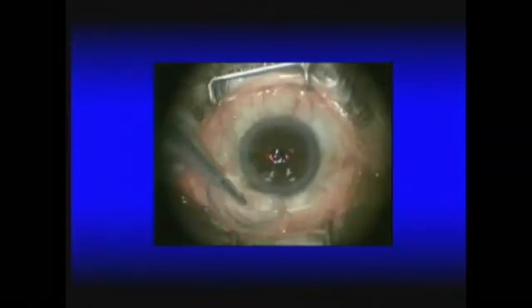I don't like to use alcohol, but you can do it. You can remove it with the alcohol and do the photoablation. This is a flying spot laser. Clean it.